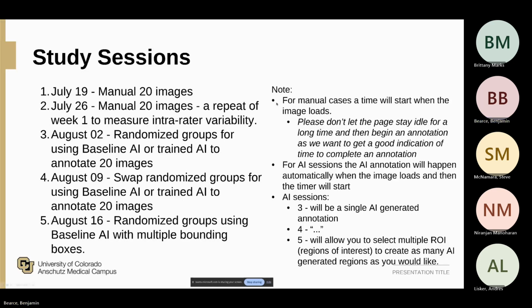For the manual cases, time will start when the image loads. Don't let that page stay idle for too long because we're trying to capture the time it takes to do an annotation. So we don't want dead time making an annotation seem like it took longer than it really did. For the AI assisted sessions, as soon as the page loads, the AI will kick off and give you its guess, and the timer will start as soon as that has rendered.